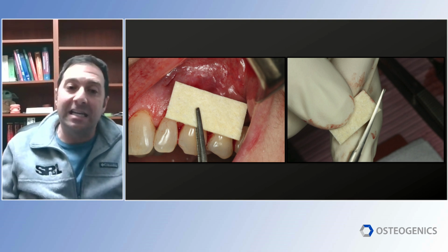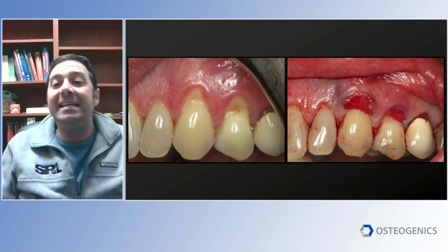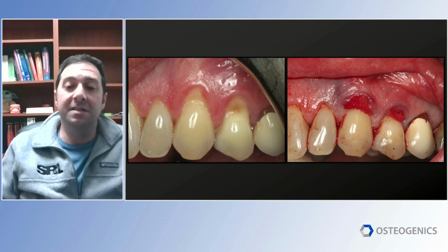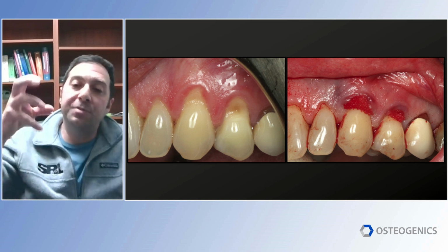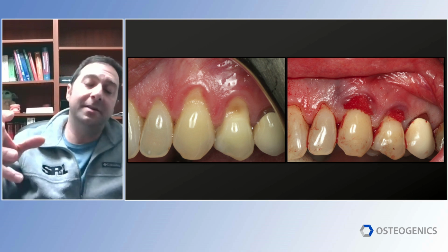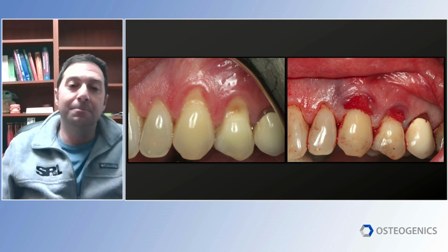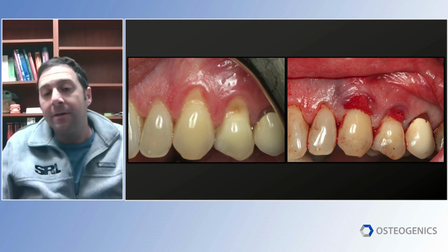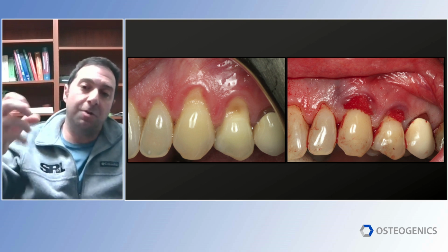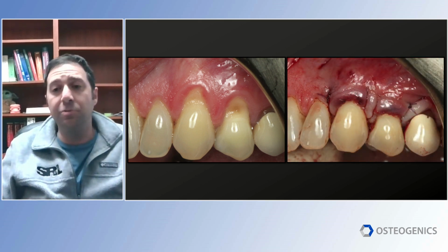Microderm is very easily cut dry. So I'm measuring it, cutting it dry, and it's very easy to insert. Actually, in this case, I inserted it right through the sulcus, and you can see how absorbent it is. Look how red it is. The first thing it sucked up was blood. I haven't tried this with any growth factors or PRP, PRF, but I'm assuming that might help. I'm not sure. But in this situation, you can see how blood is just soaked up into the microderm, sutured with just 2 sling sutures.